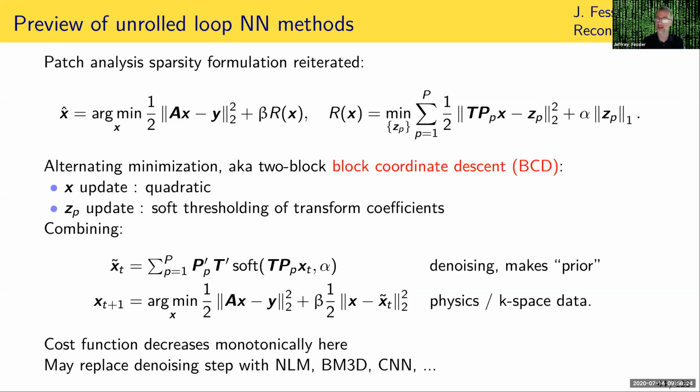The result of that is essentially a denoised image if your transform is any good and if your thresholds are chosen appropriately. So you've taken your current image and denoised it, and once you rewrite this after solving, this regularizer turns into just a simple shifted Tikhonov-like regularizer that involves the difference between X and that synthesized or denoised image.